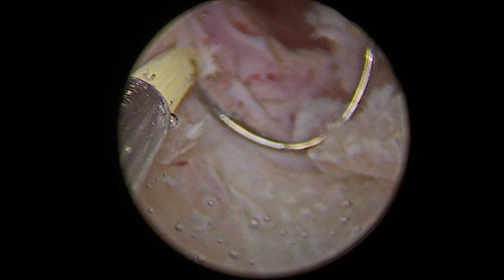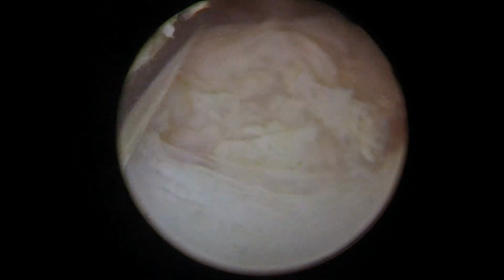To remove the submucosal fibroid of this type 2 myoma needs a little bit of expertise. That means we have to nibble the myoma out of the myometrium. Once we resect the mucosa and the surrounding capsularis of the myoma, the myoma usually pops out into the uterine cavity, but it will not be so easy.